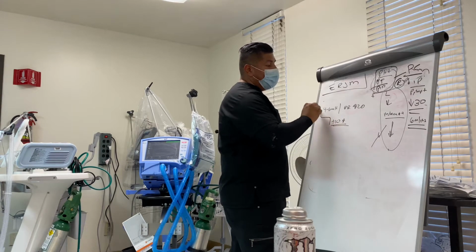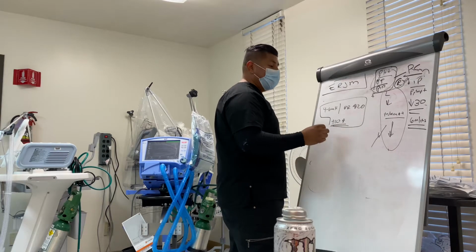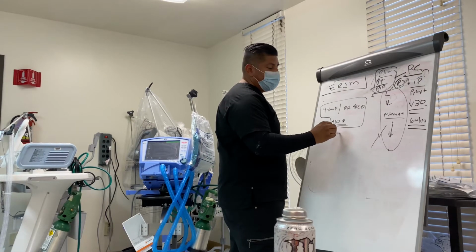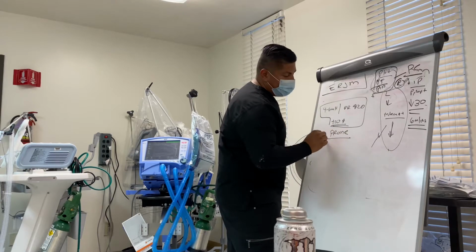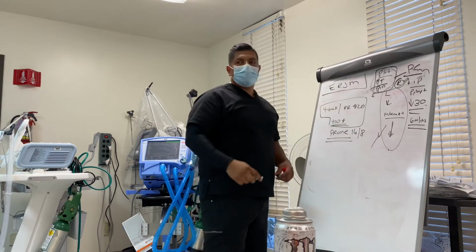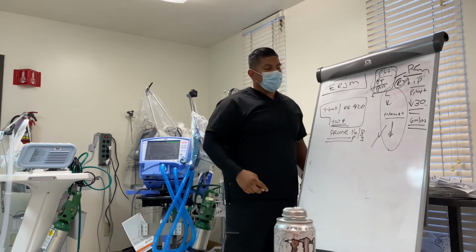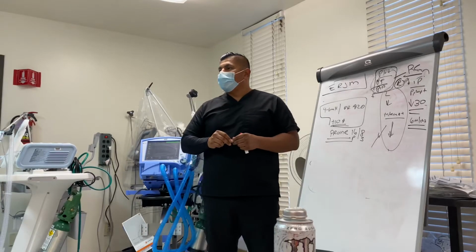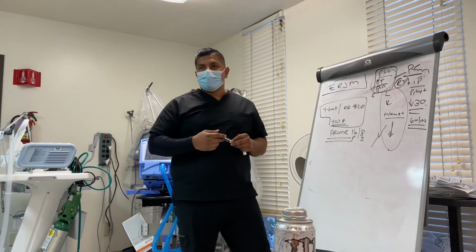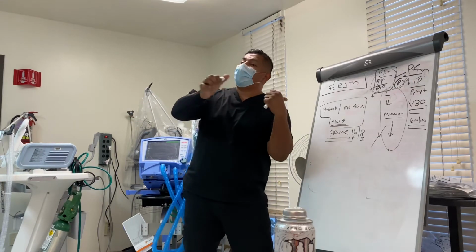Okay, and you want to make sure that if possible, to help improve oxygenation, you prone the patient for 16 hours, supine for 8. Now, I'm not sure if you guys are there yet, that's more of an FYI, okay?